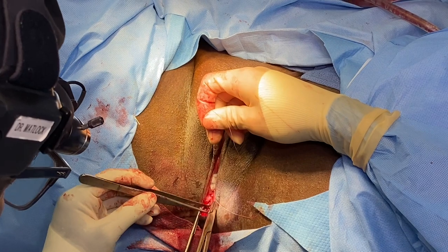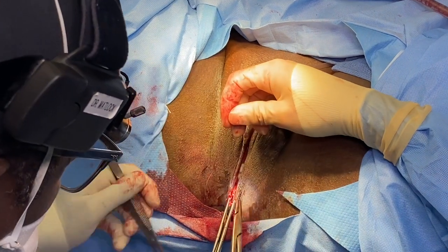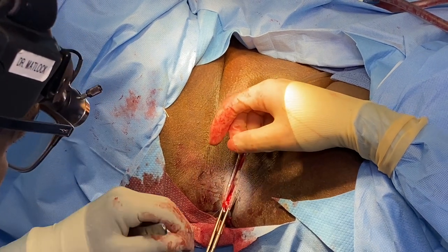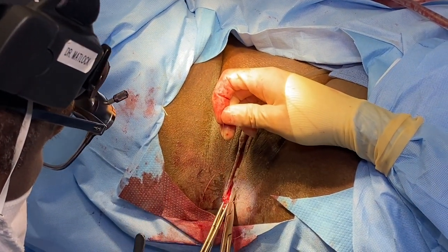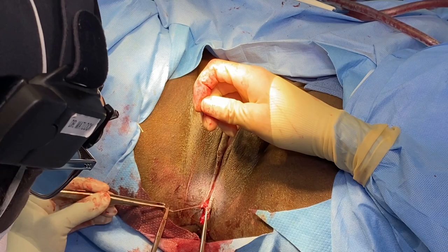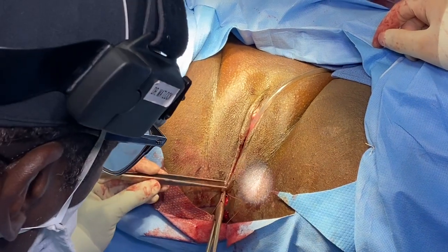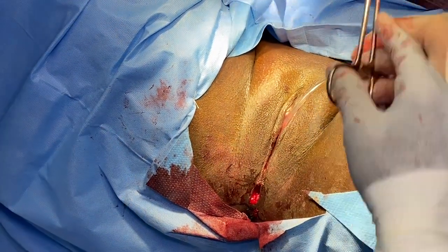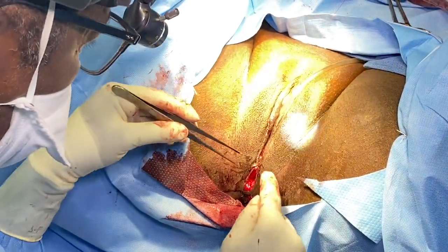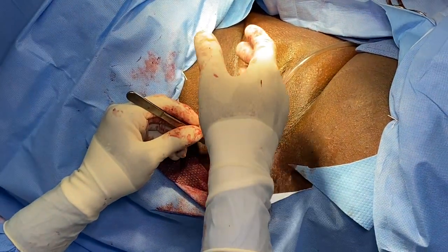Then after this, we're going to close the superficial and deep transverse perinei muscles. We're going to bring those back together. Tighten those. Now, this is the superficial and deep transverse perinei muscles. That's the support for the perineum.